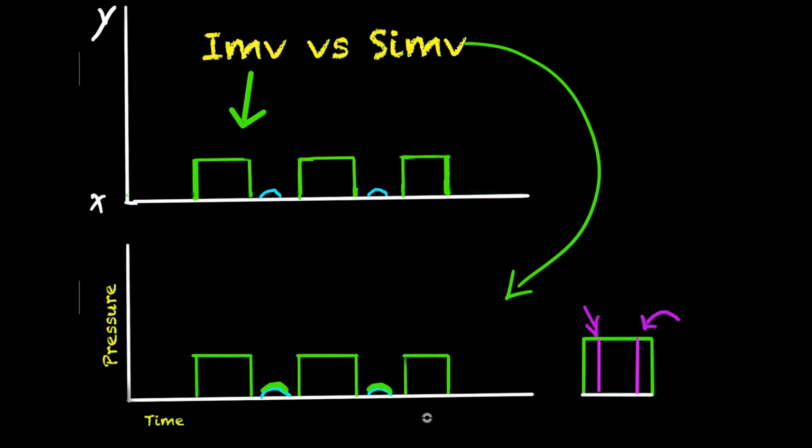Now, on a volume controlled, pressure controlled, or IMV, if they try to take a big effort near the end of the case, they're always going to start coughing and bucking on the ET tube, and then the surgeon will scream at you, "The patient's awake." So I love this during the operative portion. If the patient can breathe spontaneously through the whole case, I'll just set a really low rate and let them breathe over the rate. However, when it comes time to extubate, I'll take them off this SIMV mode and just take them off the ventilator and let their spontaneous respirations take over.